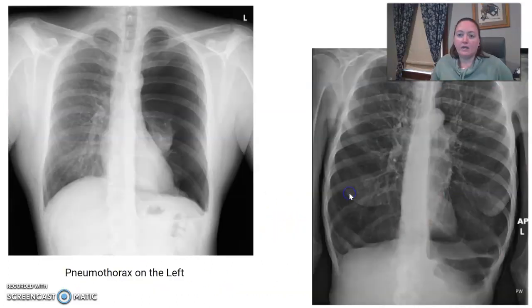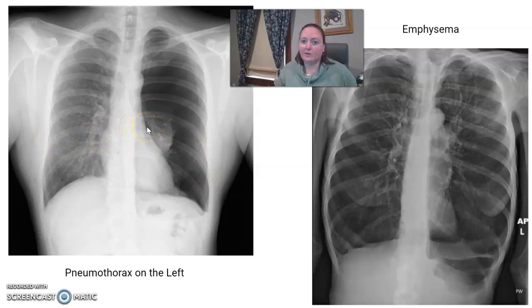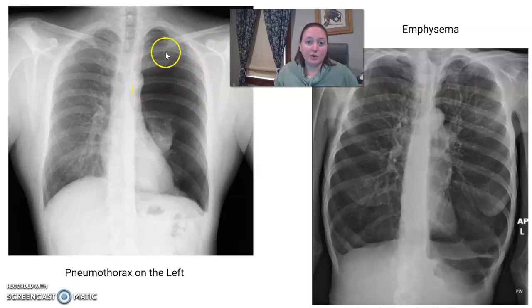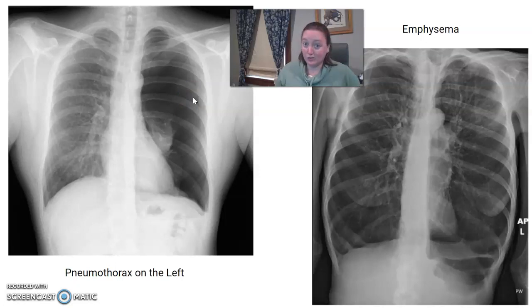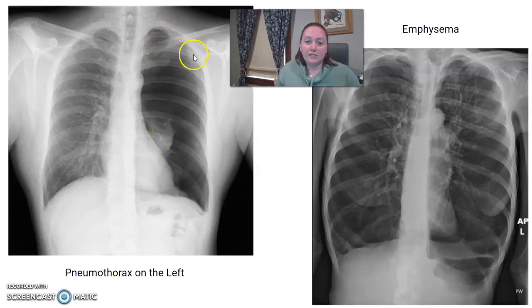Let's look at two pictures showing the different ones you might see. The pneumothorax on this chest x-ray is on the left side. If you look at the two sides, think about which is the good side and which is the bad side. A lot of times students or new techs will think the side with all the lines is the bad side, but actually the side with a very clear black appearance and no lung markings is the bad side — that's the pneumothorax. There's air in the pleural space; this is a massive pneumothorax, and the lung has collapsed way down. That air pushed on the lung tissue and it's now collapsed into a small space.